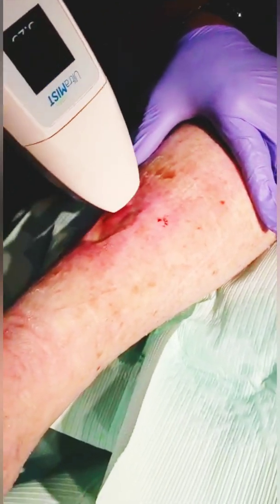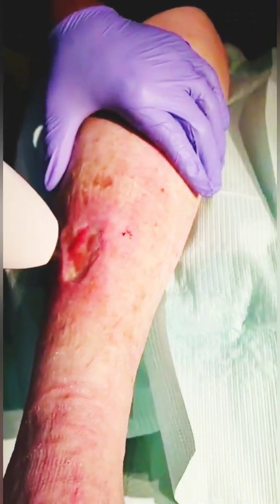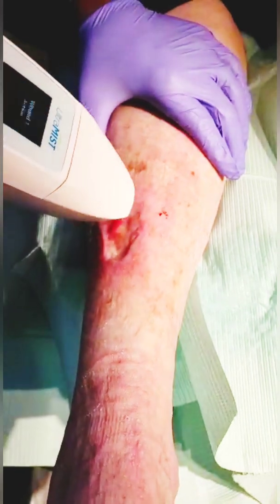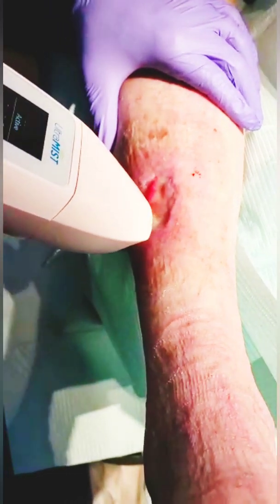You want to get about one centimeter away from the wound — get as close as you can without actually touching it. I'm told that you do not want to stay in one location; you want to go over basically square centimeter by square centimeter. You'll see there's some misting because the ultrasound waves are going in, and that can excite the tissue and heat it up as well.